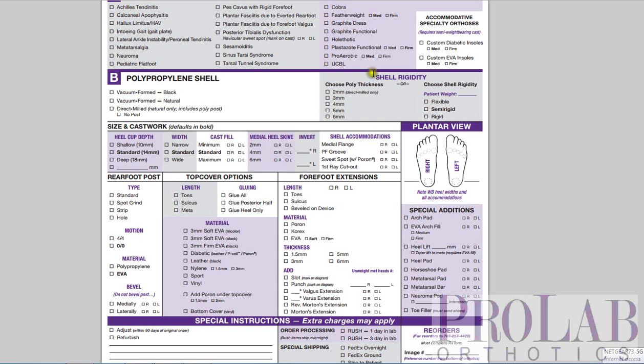So when you're prescribing a shell rigidity, you have a couple of choices. The easiest thing is just to go over here and choose the rigidity that you want. Most of the time you'll choose a semi-rigid, and then we will pick the correct thickness of polypropylene based on whether you're picking direct milled, and based on the weight of the patient and the height of the arch. But if you want to choose your own thickness, you can go over here. The direct milled, we can go as thin as 2 millimeters and up to 6. And the vacuum-formed, we can start at 3 millimeters and go up to 6. But keep in mind, direct milled tends to be a little bit more rigid.